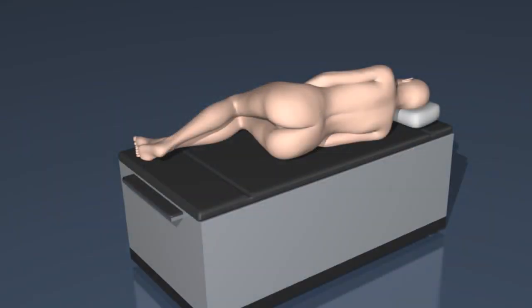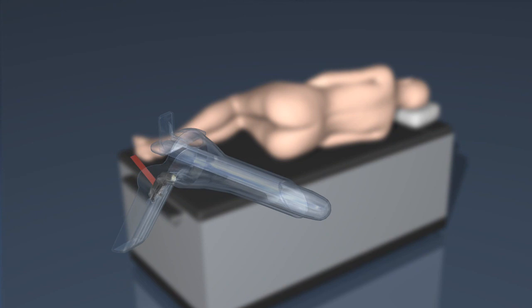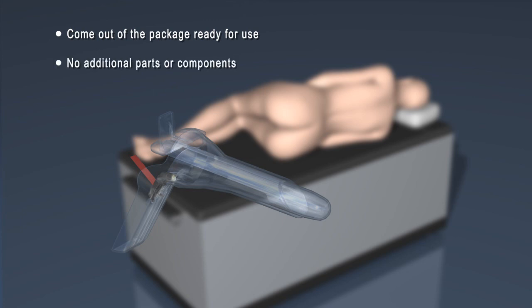The Anaspec makes the process of setting up an anoscope procedure faster and simpler than it's ever been. Each Anaspec comes out of the package ready for use. No additional parts or components are required.